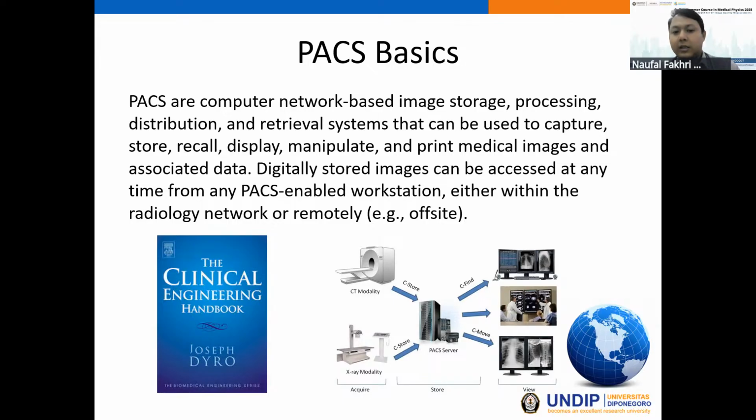So digitally stored images can be accessed at any time from a PACS-enabled workstation, either within the radiology network or remotely. This definition is taken from the book Clinical Engineering Handbook.